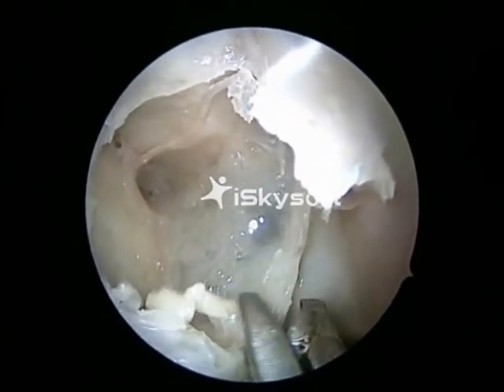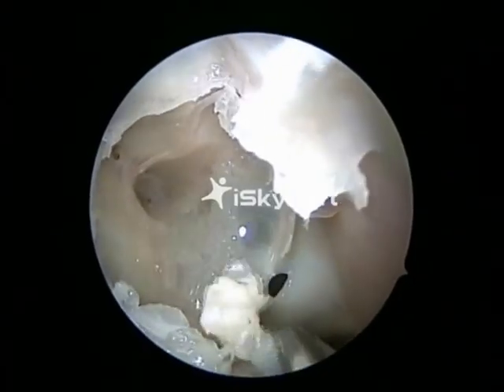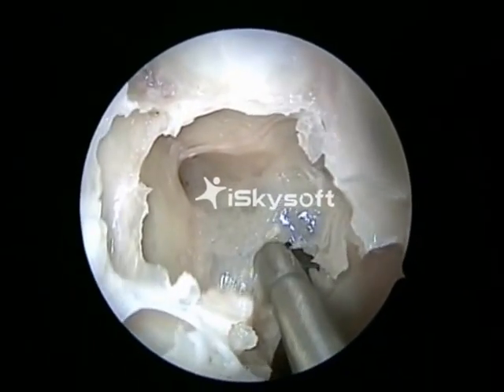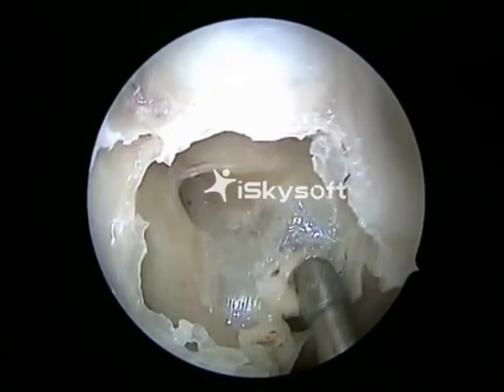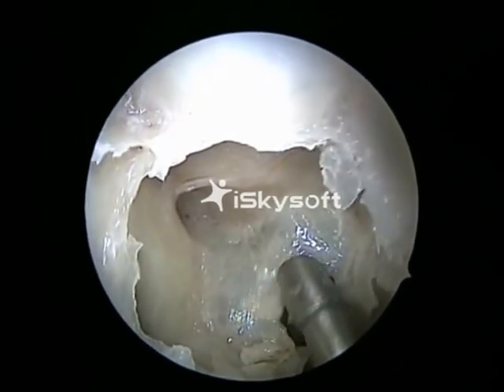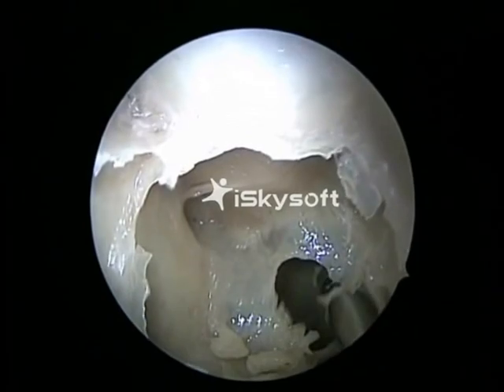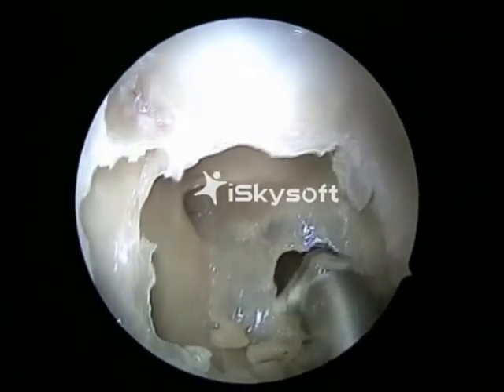And once this is done, the natural sphenoid ostium is seen very well. And we use a Stammberger's mushroom punch to widen the sphenoid ostium. This instrument is a very useful and delicate instrument for widening the sphenoid sinus. It prevents injury to vital structures like the optic nerve or the internal carotid artery.